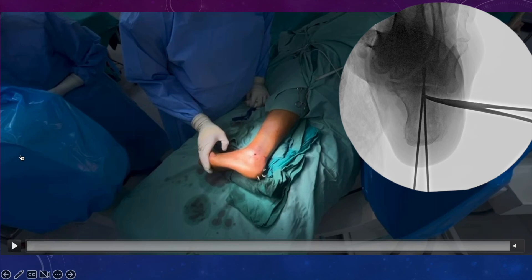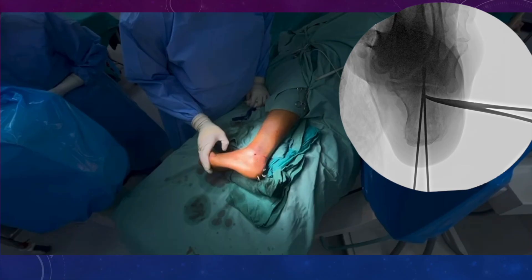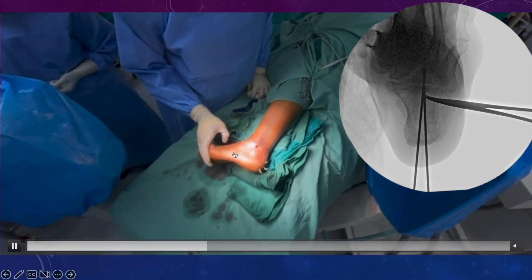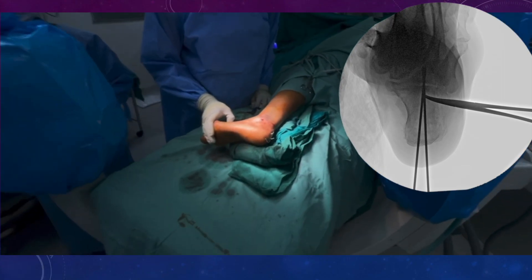Now you see we have rotated the C-arm console as we normally do for lateral views, so the beam is now passing in line with the posterior facet and we should get a good axial view. You see the foot end of the table is free and there is no hindrance to the C-arm console. The beam is passing in this direction, which is actually representing the posterior facet, and therefore there is no hindrance in the axial view for the calcaneum.